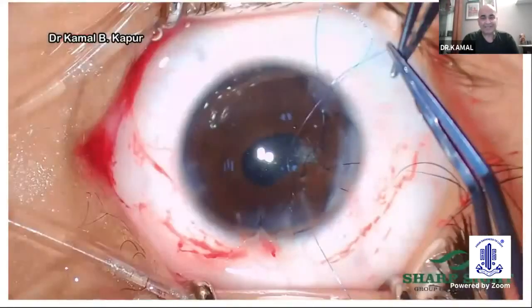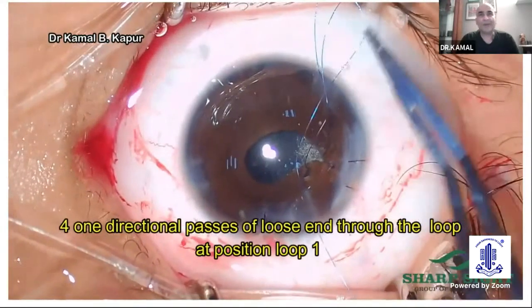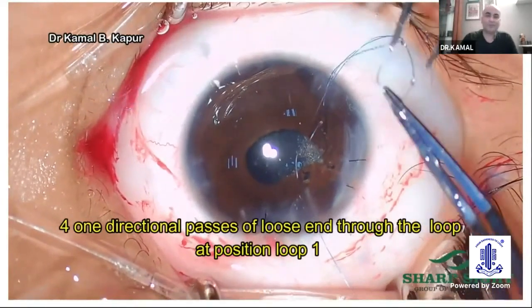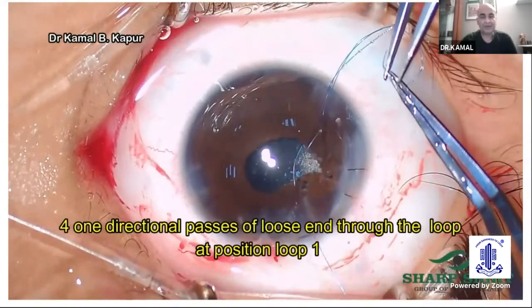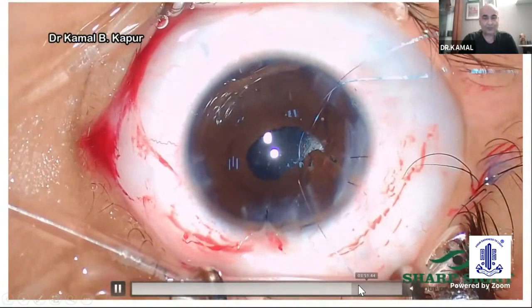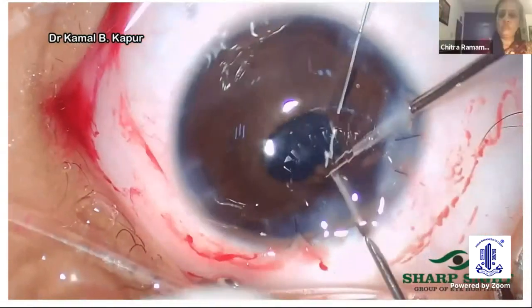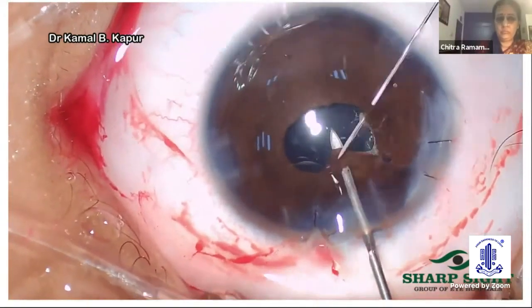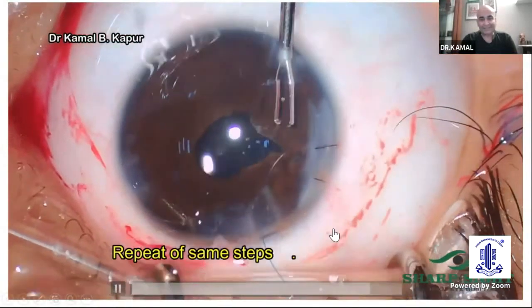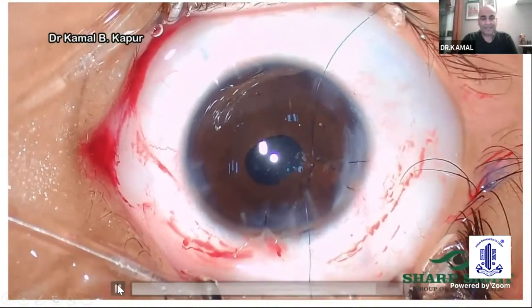Now in this particular case, before I do that, I always put a very small amount of pilocarpine before I do an iris repair. It gives me a very fair idea of what is the pupil size I would be looking at achieving. Now, once this is done, I will proceed to do another single pass 4-throw technique. And now having done the second one, I will proceed again to close the pupil to make it as round as possible. And now once this is done, I use the forceps borrowed from my retina colleagues, and this works excellent.